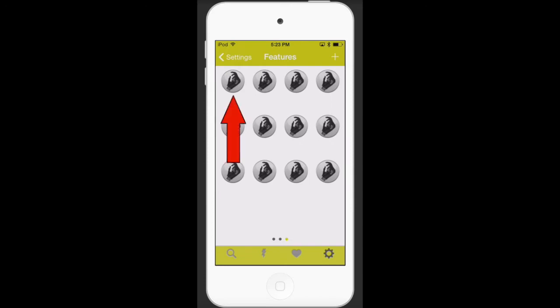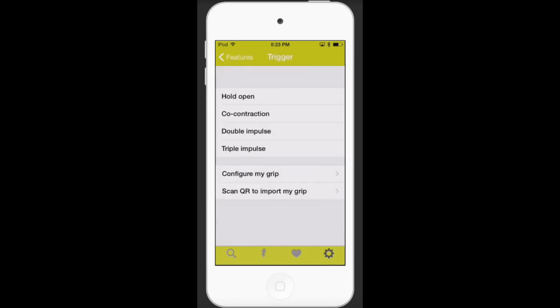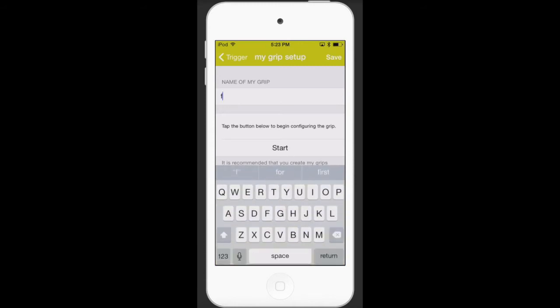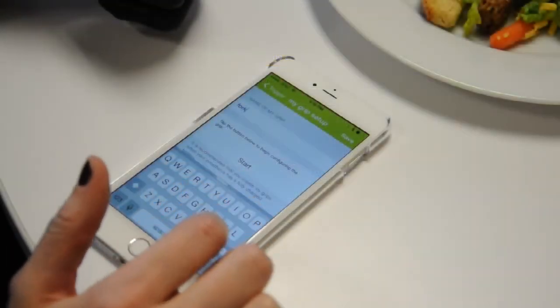Select a blank MyGrip to program. Once you've selected a blank MyGrip, choose Configure MyGrip on the following screen. Give the MyGrip a name, then hit Start to begin the programming process.